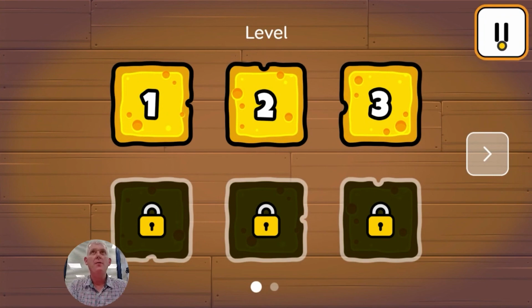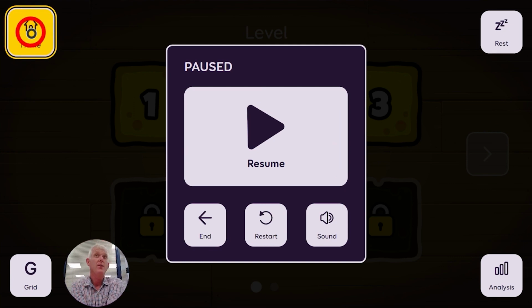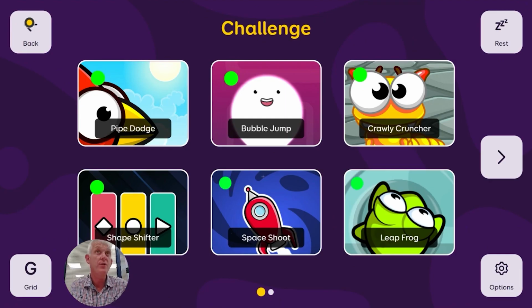So I won't go on, but hopefully you can see how the level of difficulty with obstacles in the way is going to gradually get more difficult. Okay, now we'll talk about someone different. Let's go back and talk about a young boy who has some visual difficulties. He's also, again, just on his early journeys of using AAC and assistive technology.